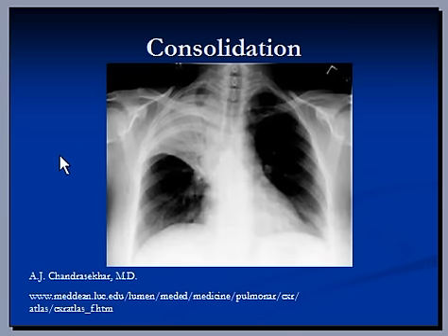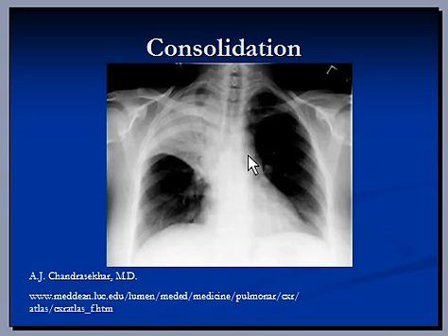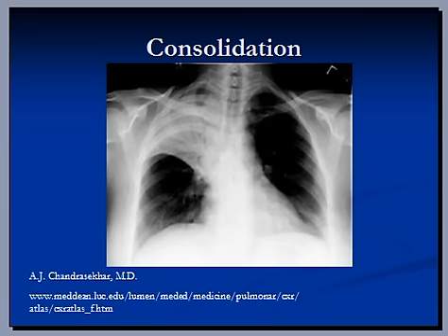Air bronchogram often indicates infection. This patient does not have any pleural effusion. The trachea is not shifted to the right or left. There is no indication to suggest a mass in the mediastinum, and no sign to suggest that lymph nodes are enlarged. This is the only finding here.